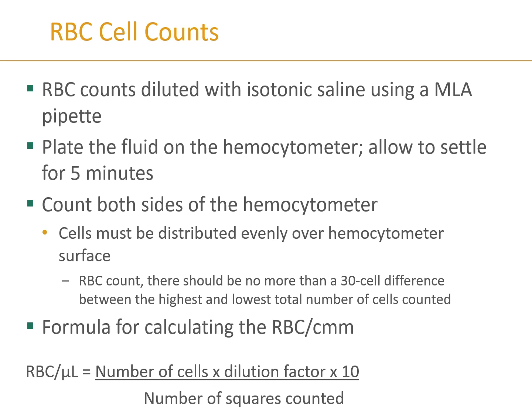Your red blood cell count can be diluted just using your regular isotonic saline. And once you put that dilution onto your hemocytometer, and of course you may not need to dilute it, there may not be any red cells present. A lot of times we'll load it and look at it first just to determine if we need to do a dilution, and then if we do, then we will do the dilutions after we've first glanced at it.